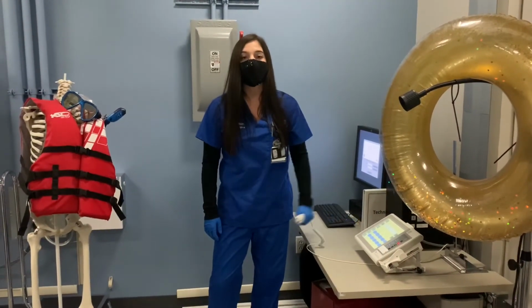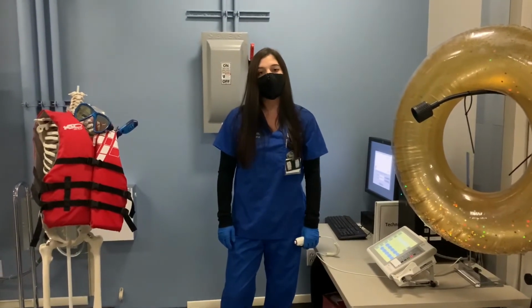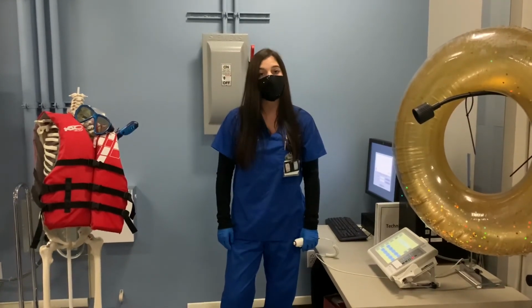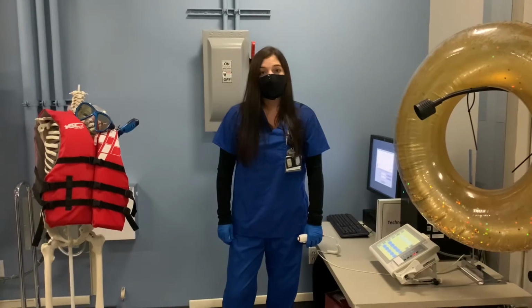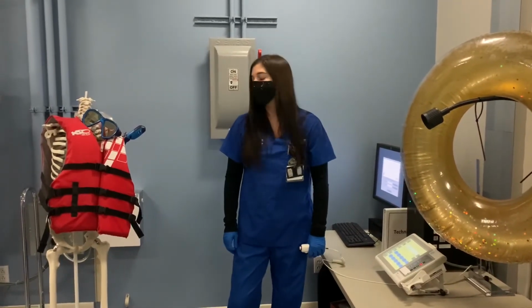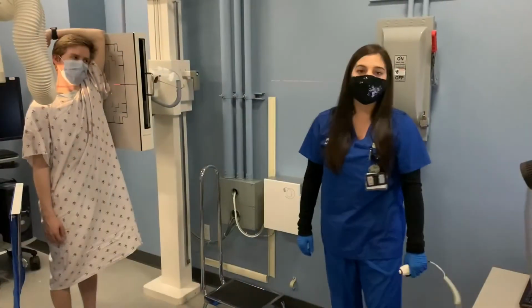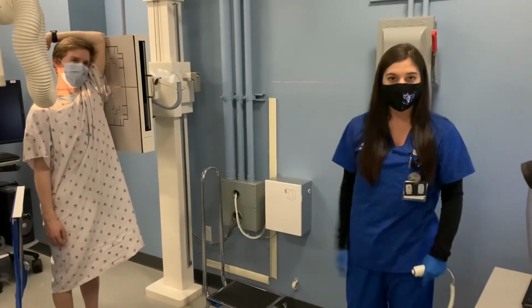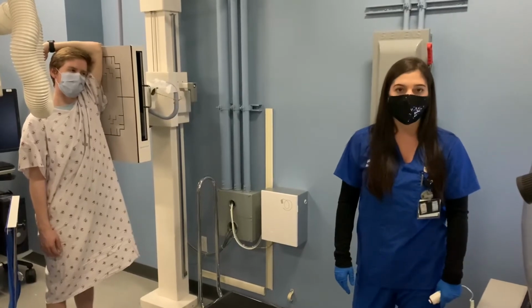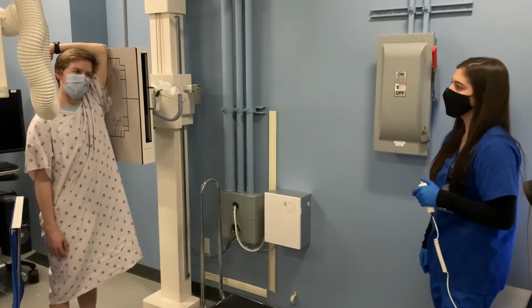Now that our patient is properly positioned, we've entered a proper technique, it's time to give some breathing instructions. For this projection is suspend respiration. When you give breathing instruction, it's very important that you give clear, concise instructions to your patient. Before exposing, it's also important to make sure that everyone is out of the room before exposing. Charlie, can you please leave the room? Now that our patient is properly positioned, we've entered a proper technique, everyone is clear of the room, it's time to expose. Mr. Steve, please hold your breath.